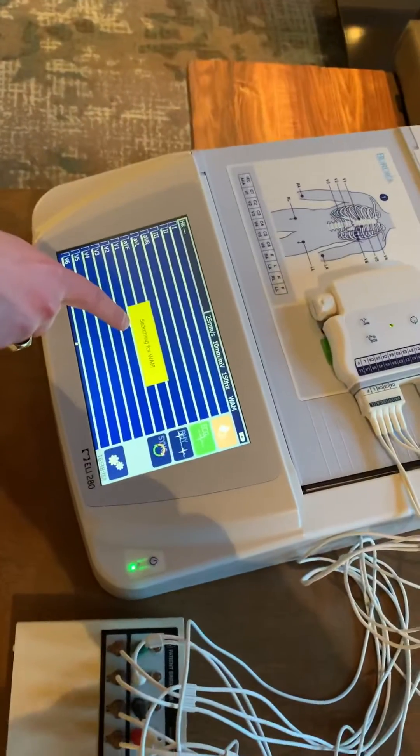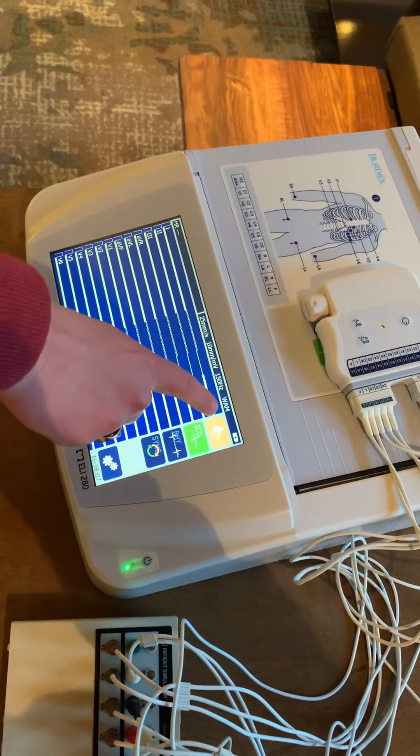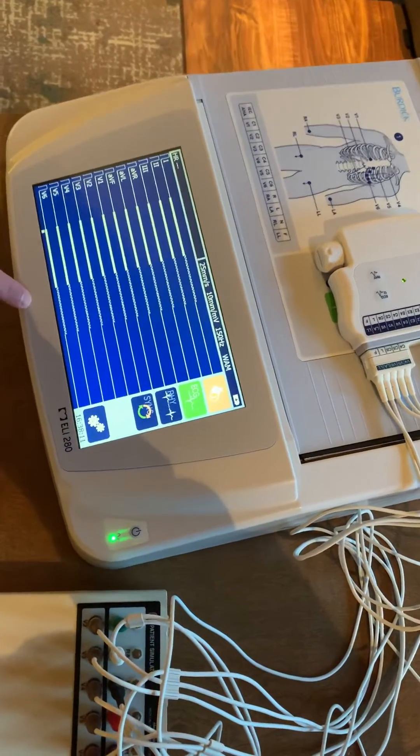You'll see a yellow informational box that's searching for the WAM. Once it is paired, you'll see the WAM icon up in the top right-hand corner, and then it is searching for leads.